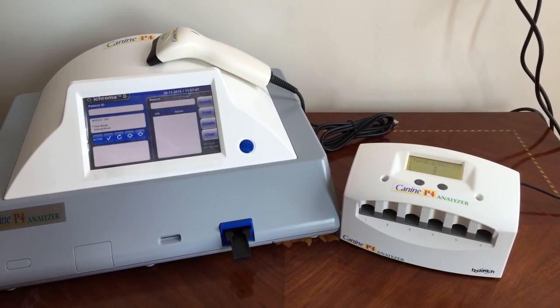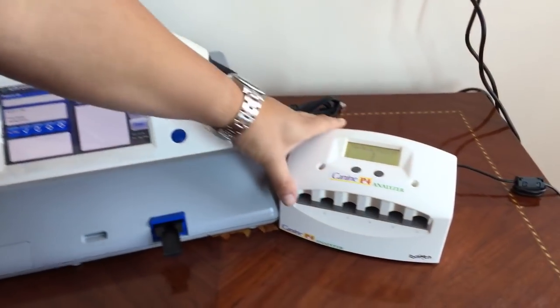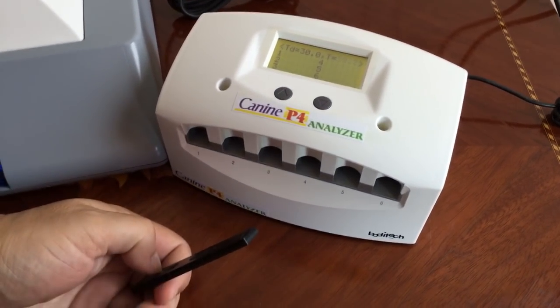Hello and thank you for purchasing the canine chamber. This is a little incubation box that makes the strips at a perfect temperature, since hormones are very temperature sensitive.